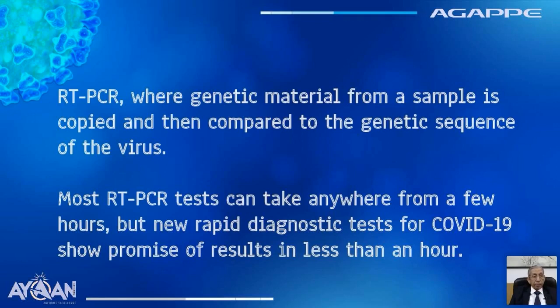That is the RT-PCR. RT means that there is reverse transcription. Now, what does that mean? The virus is an RNA. And therefore, that RNA has to be first extracted. See, a swab is taken and that virus will be there. That RNA has to be extracted first. That needs certain chemicals, some kits, etc. And from that, the RNA is taken.